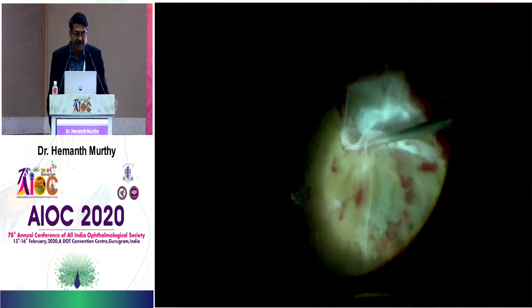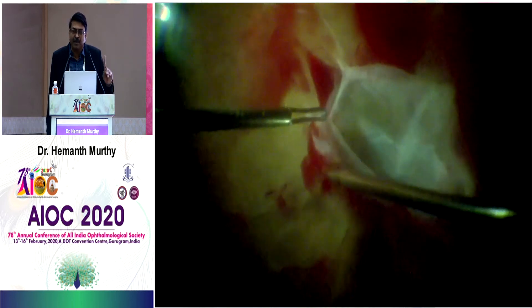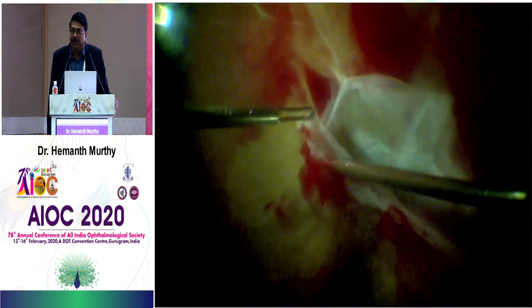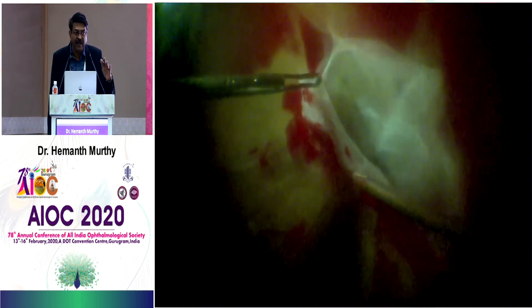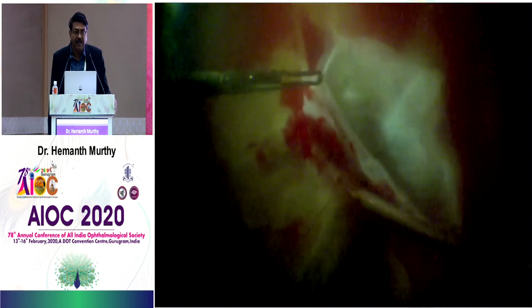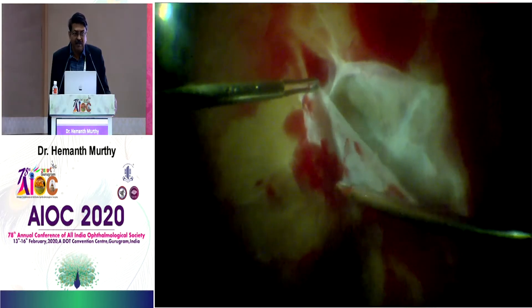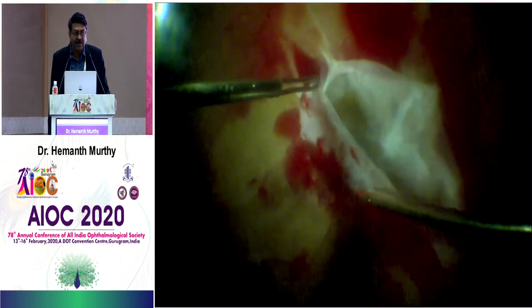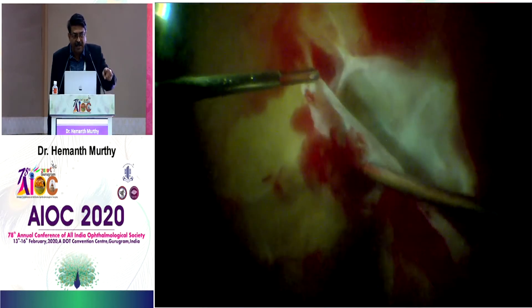There are situations when you have a broad adhesion. In broad adhesions, the best approach is to use bimanual technique. Here the broad adhesion is at the macula, so I know that if I start dissecting only with the probe, it will damage the macula. So I use bimanual dissection to help me out.